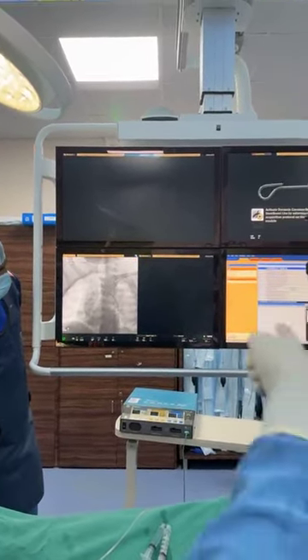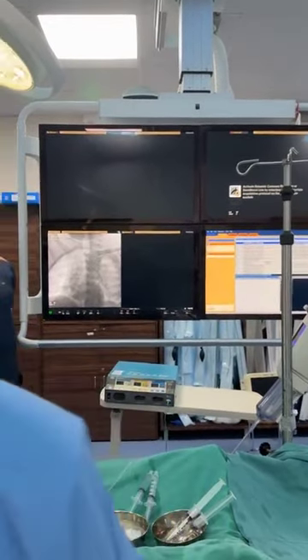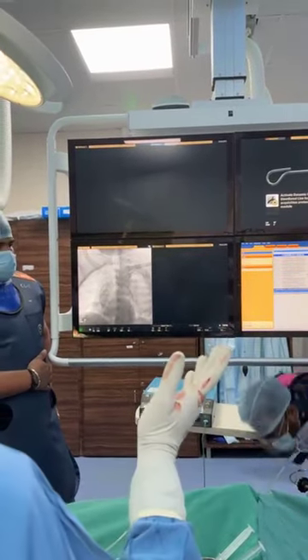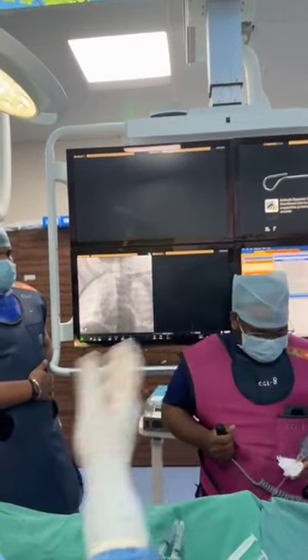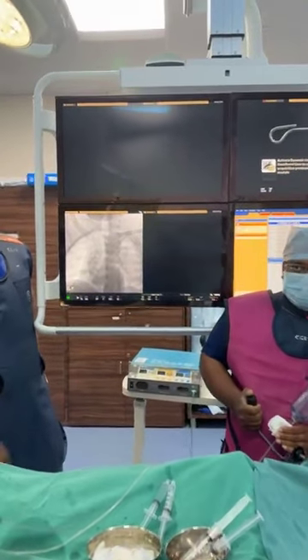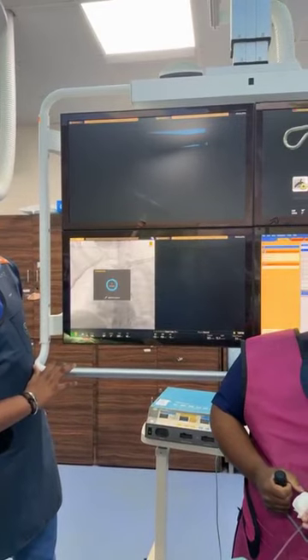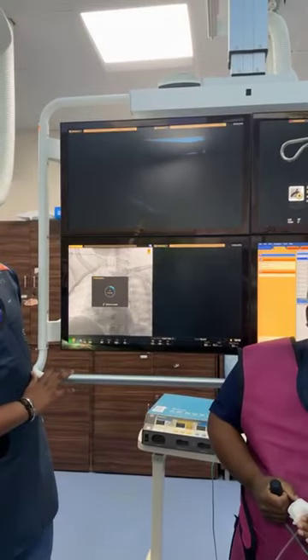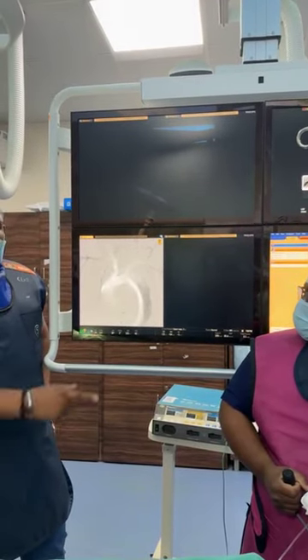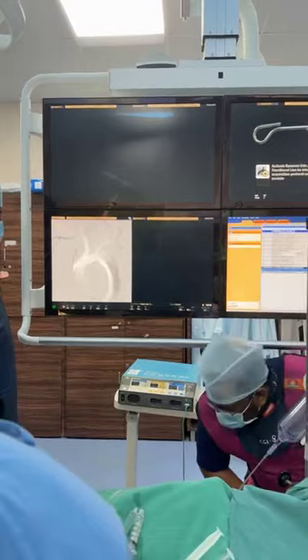Okay. Go there for the injection. I request for apnea in 1 second. Are you ready, Prashant? Yes, sir. Both are Prashant, Dr. Prashant and Hero Prashant. Are you ready? Ready, sir. Okay, apnea, please. It's coupled. Okay, no problem. That's okay. Ventilate.